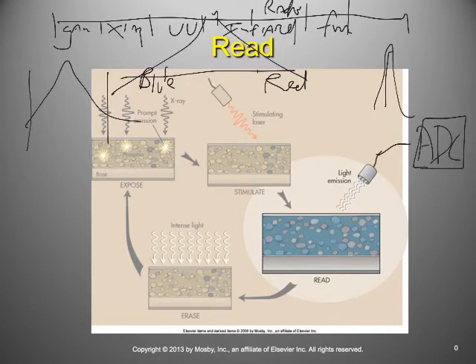Now, I would want to digitize a certain spectrum of energy. Basically, any blue-green kind of light, indigo light, I'll want to digitize. I do not want to digitize anything that's red because that's the laser. I don't want to digitize the laser. I just want to digitize certain wavelengths. So the computer has a way of knowing what wavelength, what color the light is. This is how the latent image in the PSP is made visible.